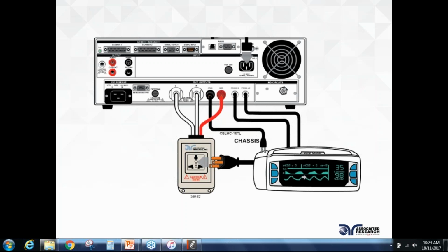We're going to actually power up this device. One of the important things about doing a leakage current test is that the device has to be powered up to the full potential. So the normal operating temperature, the normal operating screens, and normal operating procedures, the device has to be fully powered on. Once the device is fully powered on, now you can start making measurements.